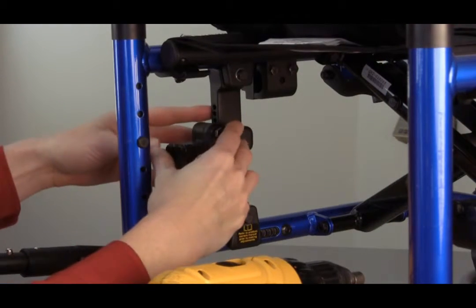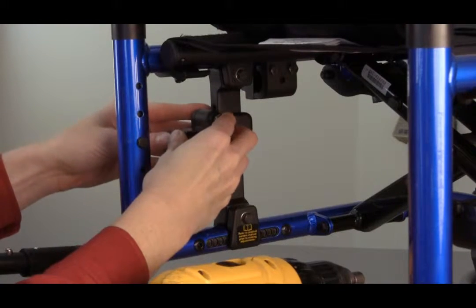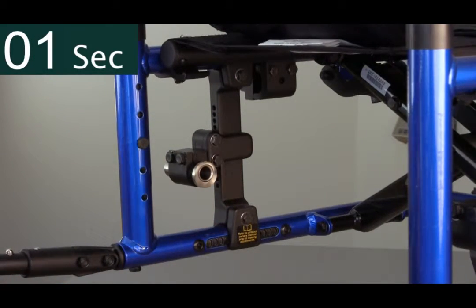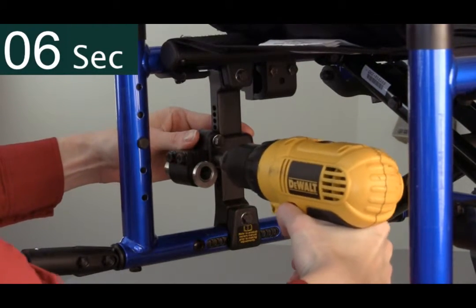Sometimes, during the final fitting, it becomes necessary to also adjust the rear seat-to-floor height. Again, using the same 10 mm tool, simply loosen the top bolt and remove the bottom bolt.